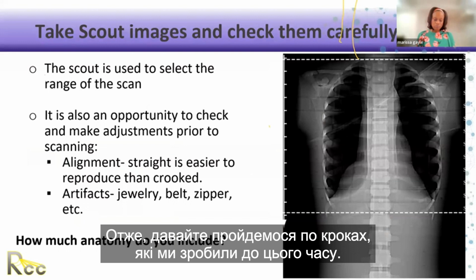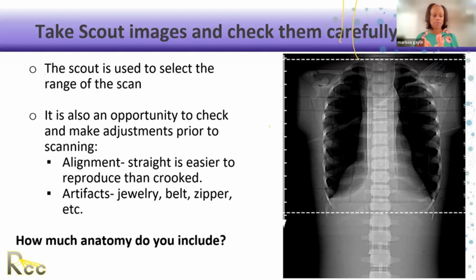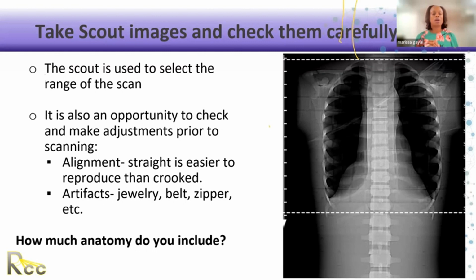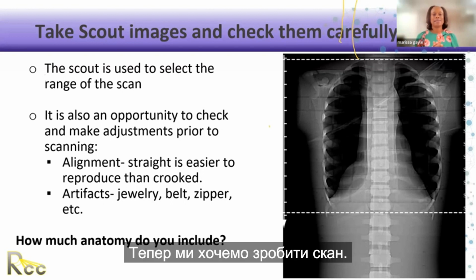Also, let's go over the steps we've done so far. Now we've made an immobilization device. We have made sure that some contrast medium has been given, be it oral contrast. We'll start with that one. We've made sure that the patient is comfortable. Now we want to take a scout.